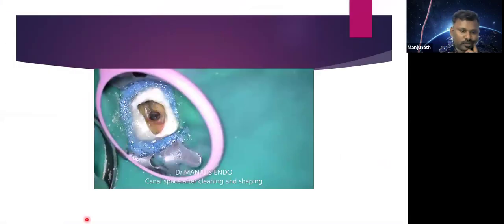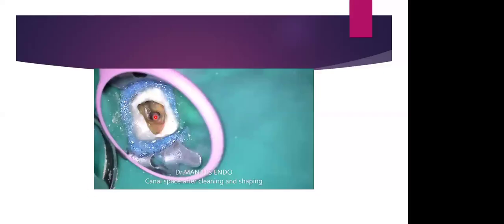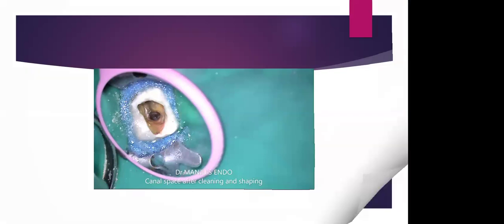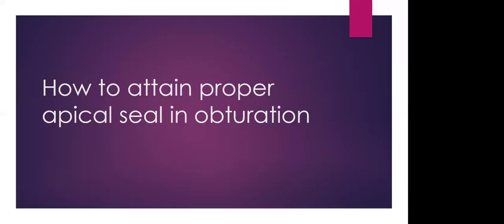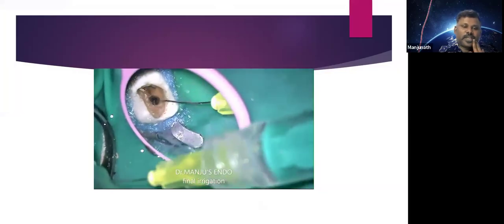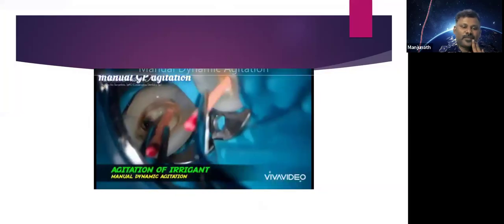This is a small video, so I have irrigation method. So this is a video to share with you. I am using a 30 gauge needle. It will reach till the middle third or the apical region, so that you have proper irrigation.